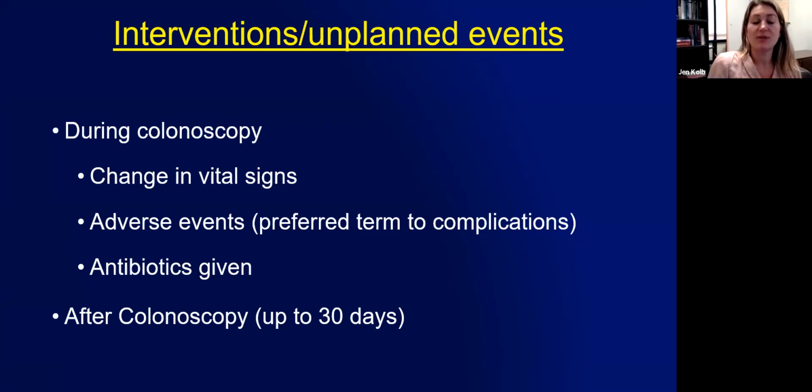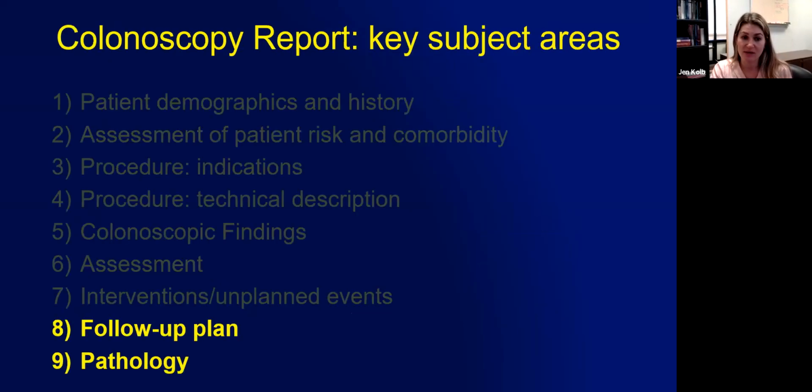So now those are really the key components of what happens during the procedure. And then the next important thing is where do you say what's next for the patient, right? What do you tell them is the follow-up plan, and what do they need to be aware of? I think many of you on this call may work with the patient before or after, and oftentimes the patients are completely clueless after the procedure, because how many times have I gone to tell a patient after a procedure what I found, what I did?